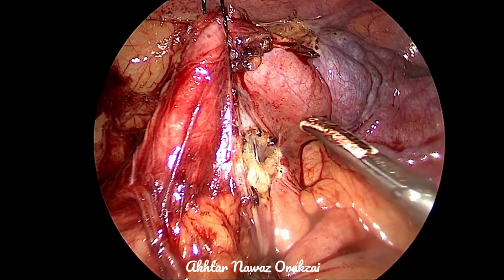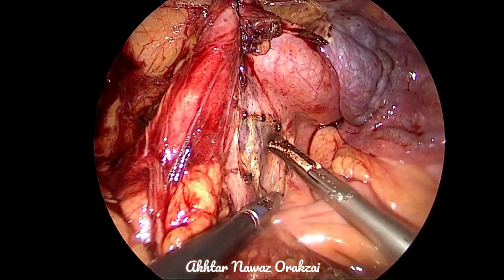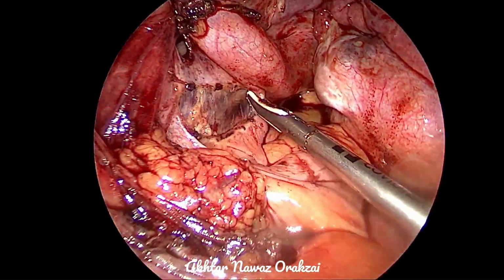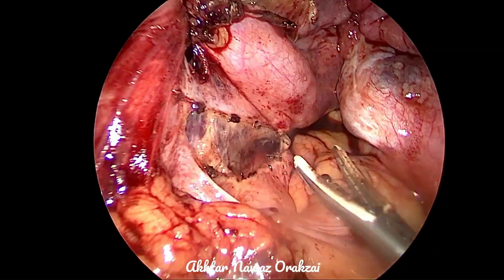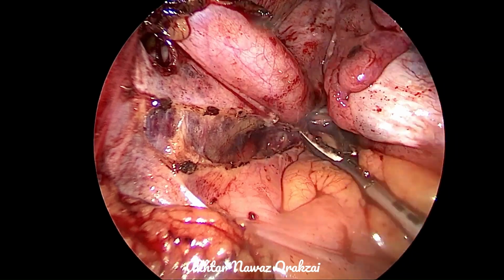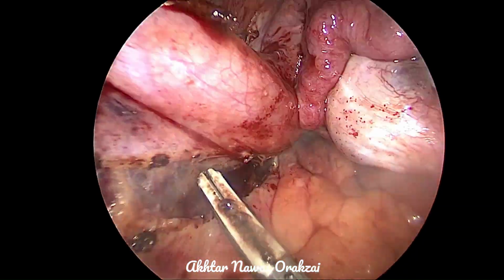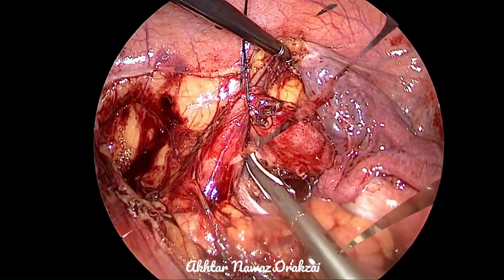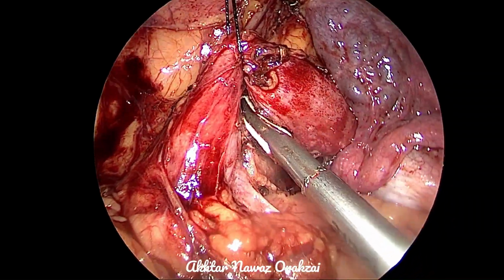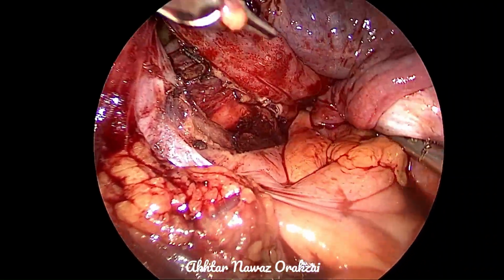Mind you, here the layer of the peritoneum, which is covering the medial aspect and anterior aspect of the ureter, will be left alone, and that too because this layer will also harbor some longitudinal small vessels which will be helpful in the vascularity. So now we mobilize this, detach it from the extra tissue as well as the fibrosis.